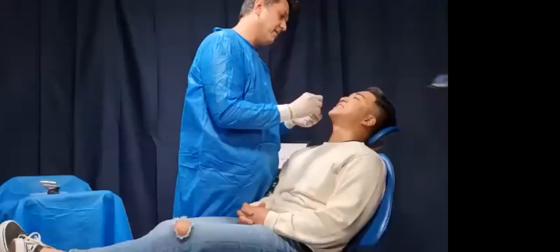So what I'm doing is I'm actually placing the wax along the occlusal surface of the lower teeth and getting my patient to bite together all the way as far as you can into centric. Now keep there, cameraman, if you can, just for a little bit longer. What I'm doing then is I pull away. Firstly, I pull away some of the wax from the buccal, just a little bit, because this pass is not too thick, especially around the centrals. Thank you, cameraman. You can pop out there.